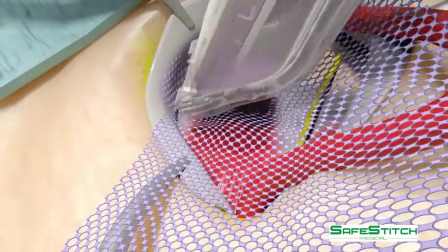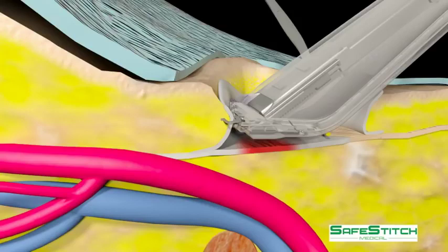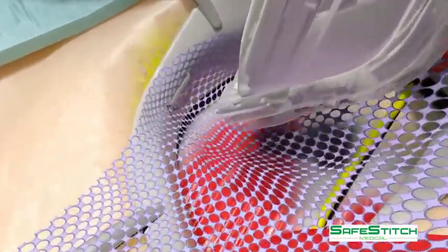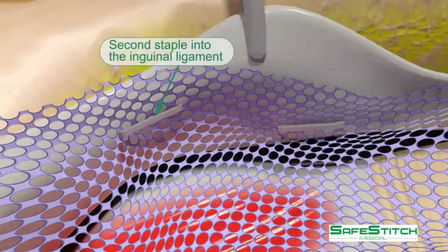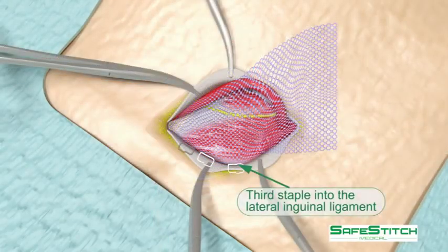The mesh is elevated into position with the manipulators. The stapler is designed to allow the staples to be fired in a parallel plane with the femoral vessels. A third staple is placed more laterally.